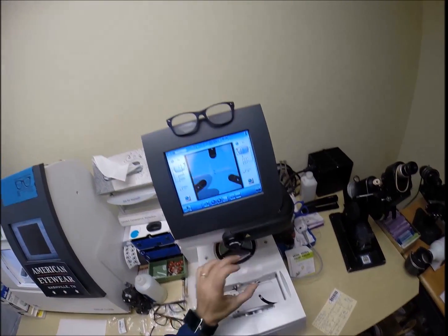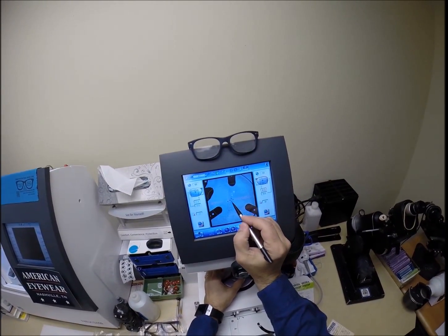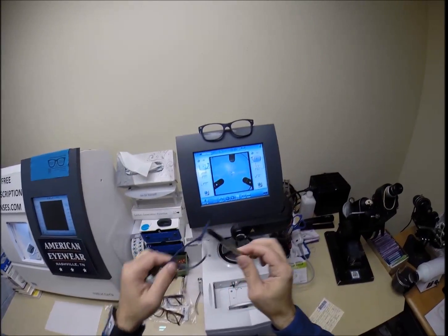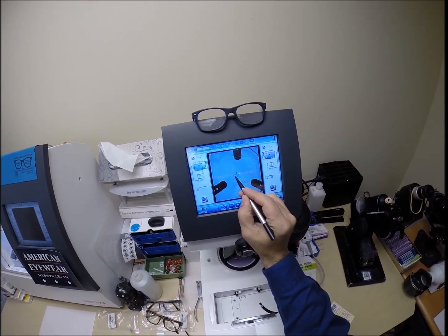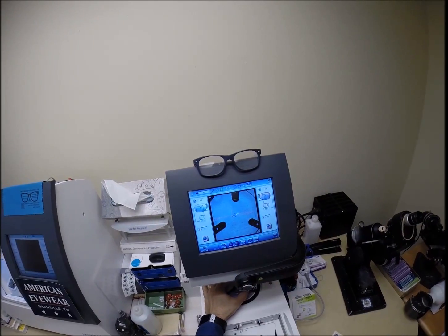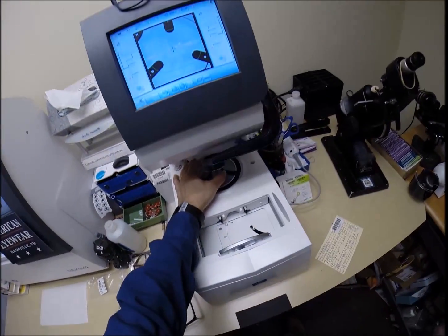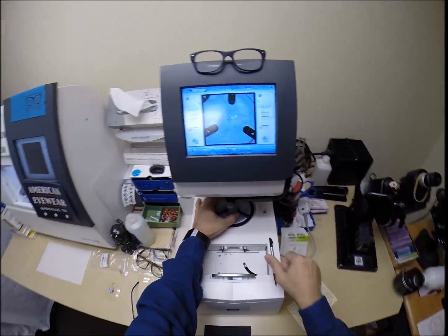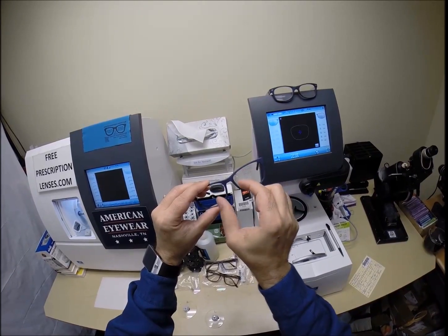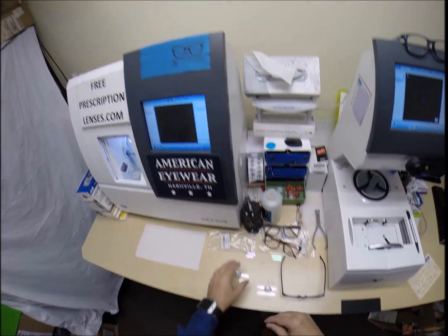And again, I'm going to put that black dot right there. Now, the blue cross is the geometric center of your frame. If you were to measure vertically and horizontally, that is dead center. Your eye is just inset from there. Your distance PD would be a little bit wider, but your eyes actually converge together when you read. Hit that button, the arm comes down. Your eyes not only come together, but they drop down here. So that's why I'm going to keep the optical center exactly where it's at.